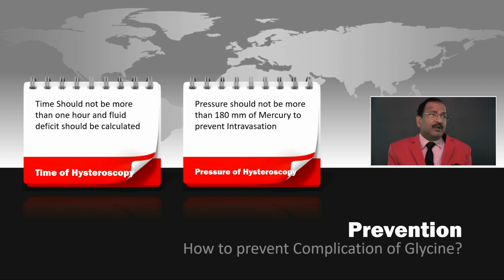Fluid should not be given pressure blindly. Some people wrap a BP cuff around the bottle and pump the BP cuff, and the BP cuff can show a maximum of 220, after that it is uncounted. And some people put a needle into the bottle and pump air into the bottle. Got my point, what I mean to say?